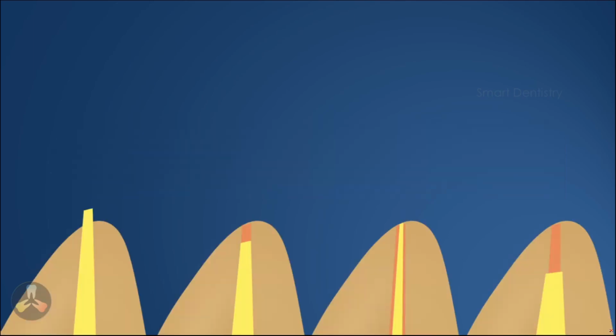I have put 4 scenarios in which we can see only the root tip and a master cone. In the first situation, the master cone is around 1 millimeter beyond the root canal tip. In the second, the master cone is around 1 millimeter short of the apex. In the third, the master cone is up to the root tip. And in the fourth, the master cone is around 2 millimeters short of the root apex. I am very sure that out of these 4 clinical scenarios, one tooth is definitely going to fail.